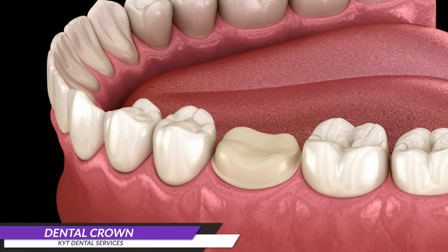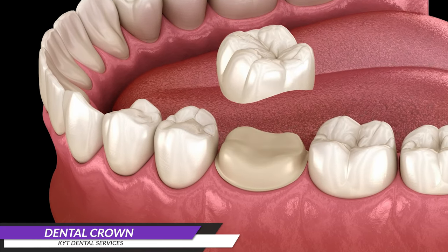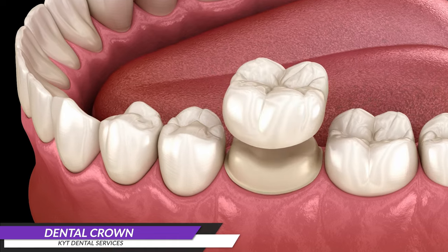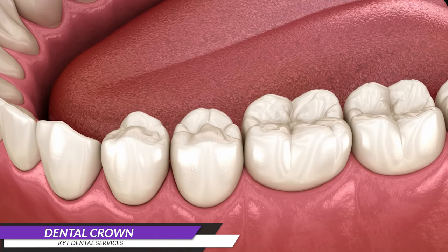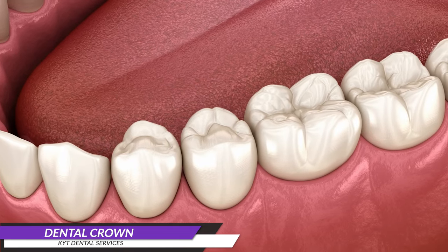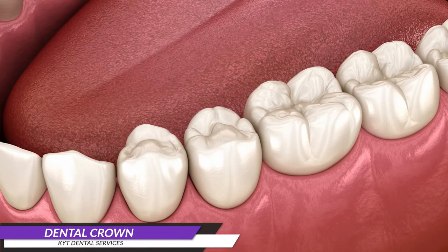After receiving the crown from the lab, the dentist will perform a try-in to ensure a proper fit and appearance before permanently cementing it onto the prepared tooth. Even after the crown is permanently cemented, adjustments of the tooth may still be necessary.